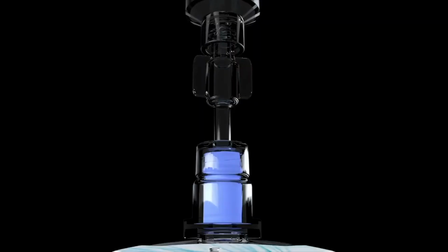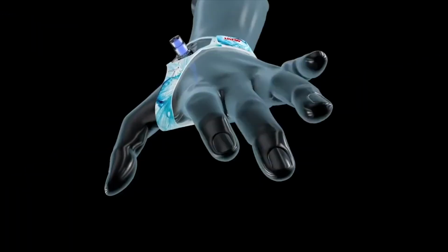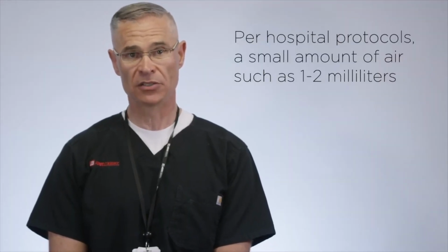If bleeding is observed at any time, inject additional air until bleeding stops and hemostasis is achieved. It is important not to exceed the max fill volume of 10 mLs. Remove the syringe. The patient should be able to move their hand or wrist freely without any bleeding. Per hospital protocol, a small amount of air, such as 1 to 2 mLs, can be removed every 15 minutes until hemostasis is achieved. Ensure a negative pressure is not pulled on the balloon.